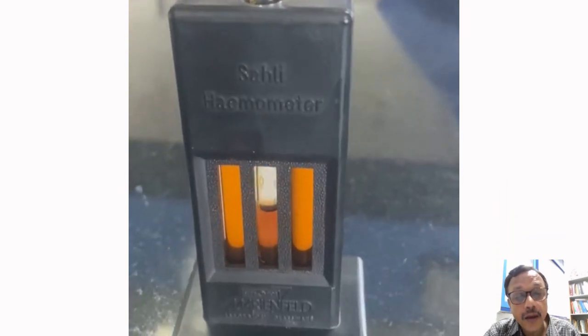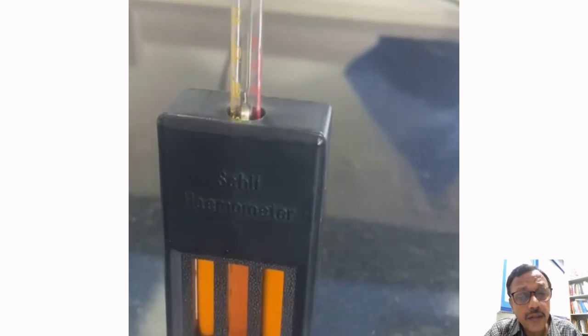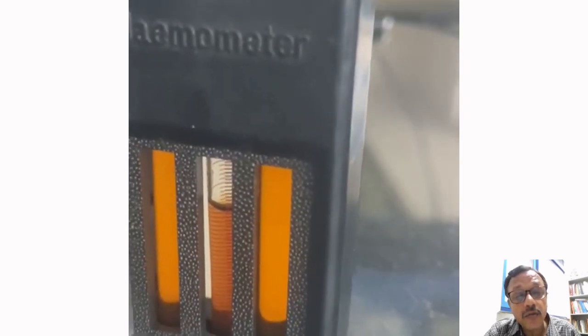Now, after waiting for 5 to 10 minutes, you add distilled water drop by drop. You mix the hemoglobin solution with the help of a stirrer until all the three glass tubes match. When all these three tubes match, take out the hemoglobinometer tube from the comparator box, but do not take out the stirrer, because if you take out the stirrer each time, a certain amount of fluid will also come out with it, which is going to hamper the hemoglobin reading.